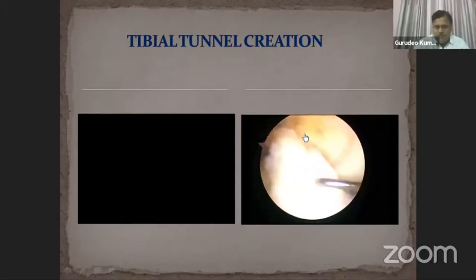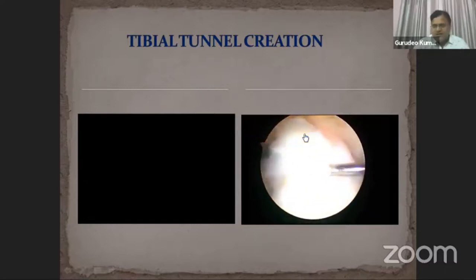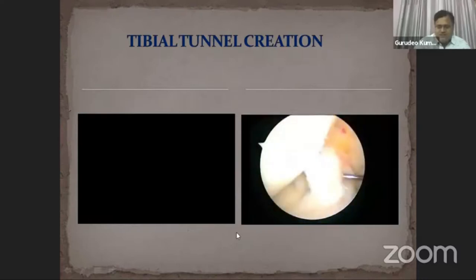Here we use two diagnostic probes to separate both the AM and PL bundles until we can see clearly into the tibial tunnel.